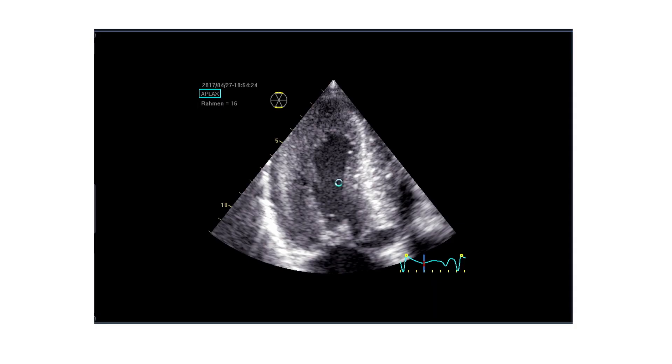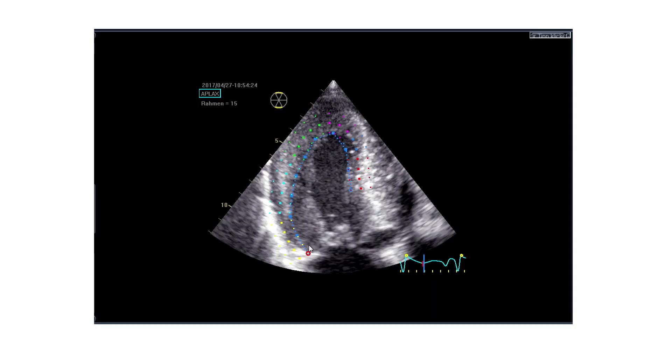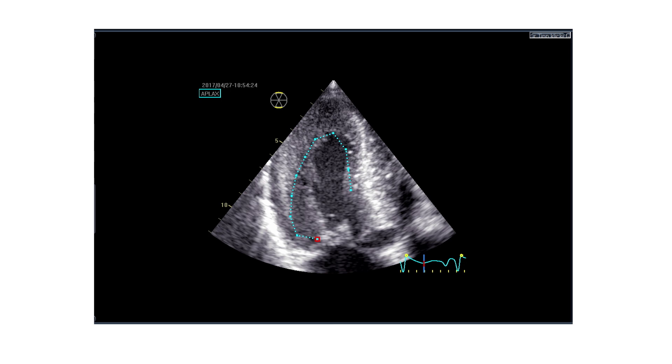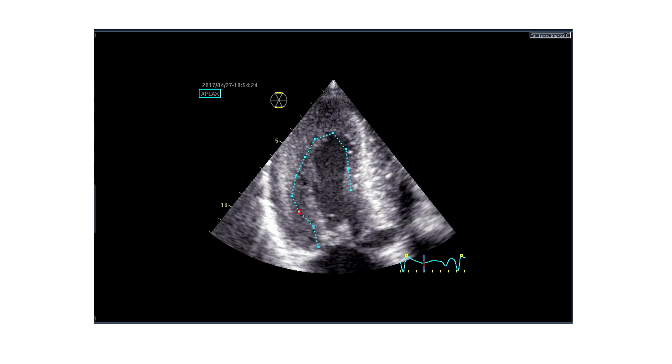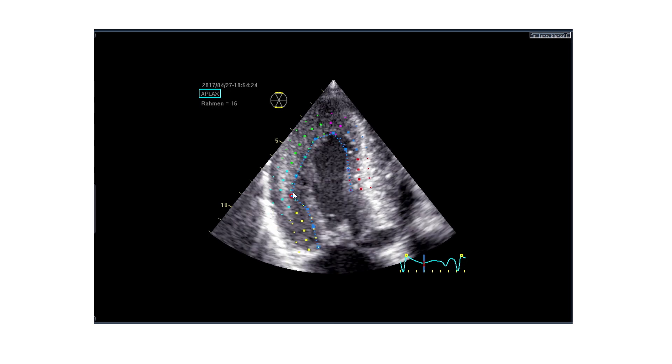So we have defined the systole in this patient previously, and I immediately go to the analysis here. I take the long axis, apical long axis, and I perform speckle tracking by the AFI mode, the automated function imaging.